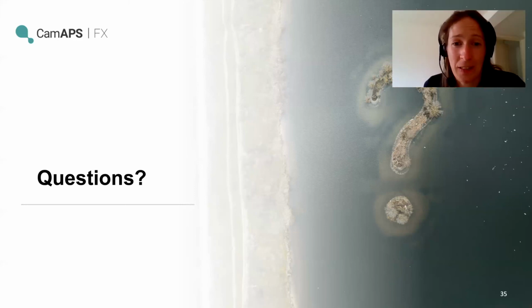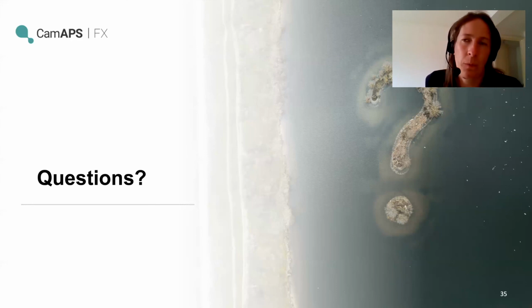So the advice is always to remove all metalwork. For some specific cases, where people might have had metallic hip implants, sometimes they will do localized scans, and it's something you'd need to have a discussion about. But removing devices and putting them back in is obviously a lot easier than removing a hip implant, so usually people would just say take the devices off rather than err on the side of caution. So the standard advice is always remove them before an MRI.